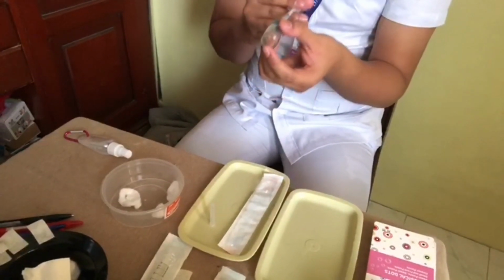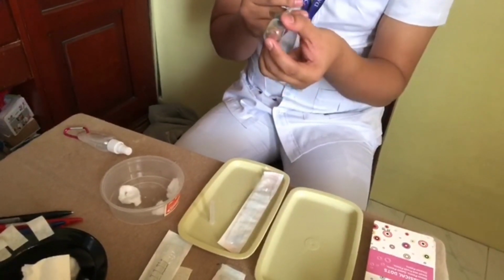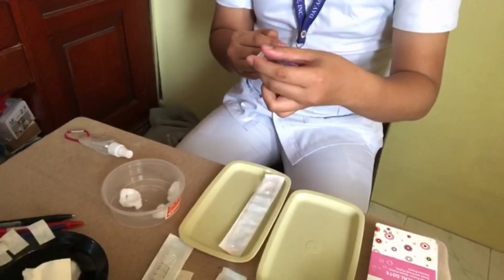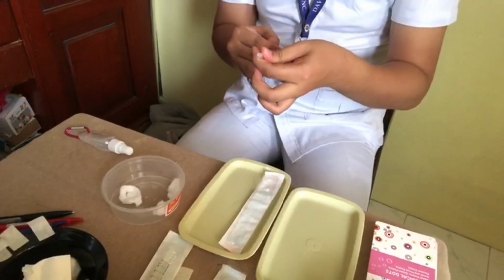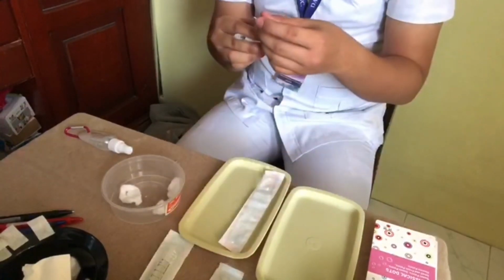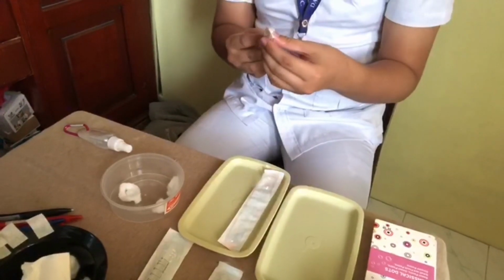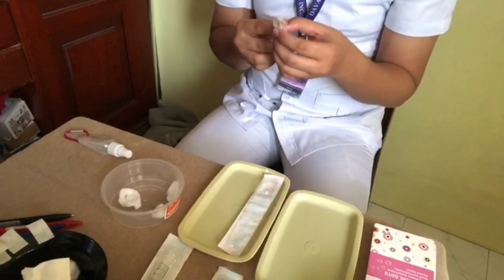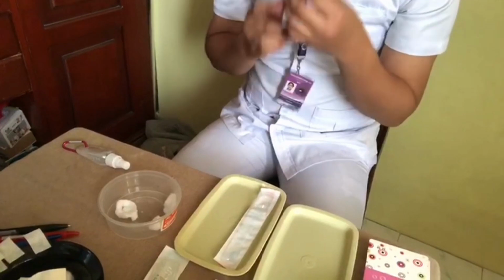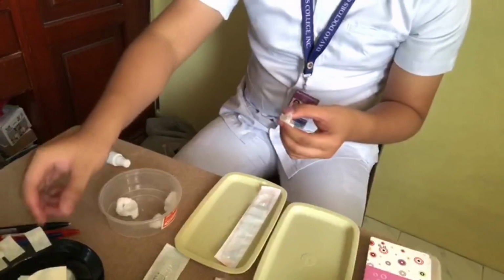and replace it with a right-size needle that will be used for the actual administration of the medication, and then discard the needle used in aspirating. I am going to remove the old needle and then replace it with a regular needle. Then also do not forget to put a marker for the name of the drug and the dosage, so that we won't forget the medication drawn into the syringe and we won't get confused.